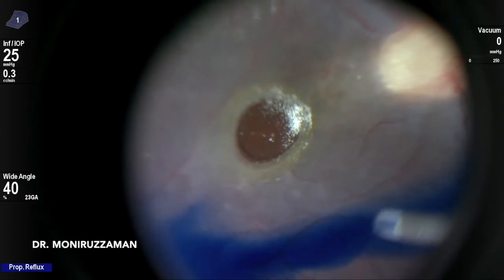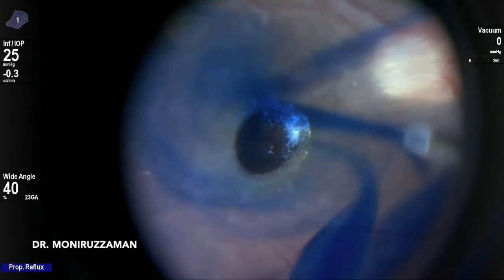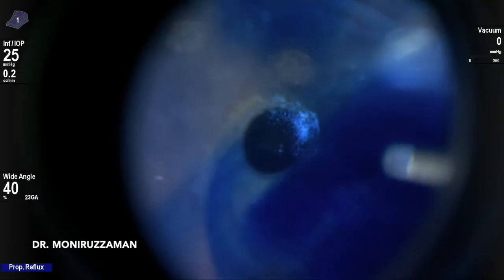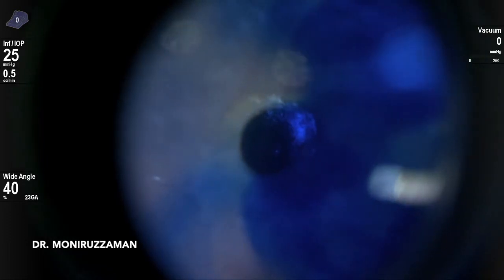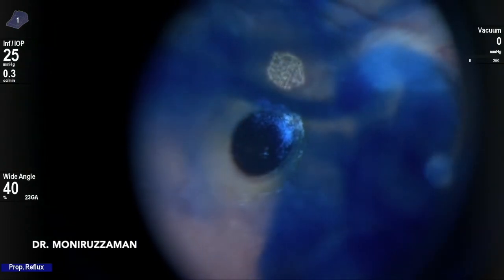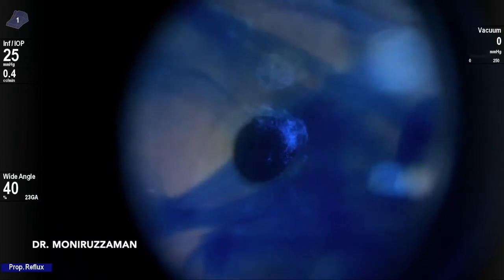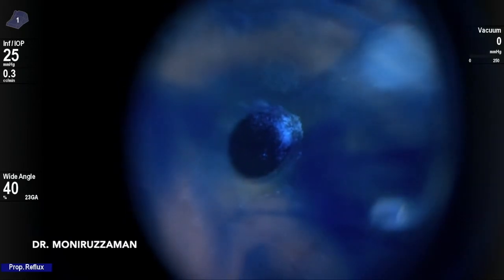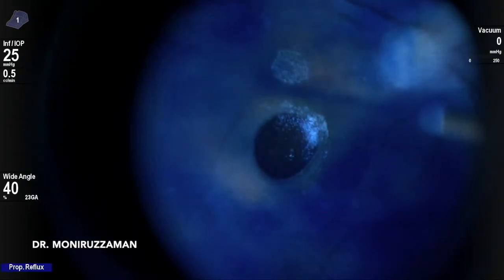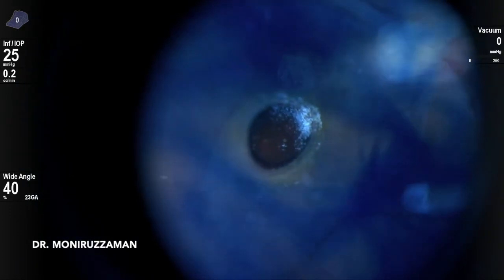For staining, I use a soft tip. I take in the dye within the soft tip by suction and inject it slowly by proportional reflux mode. It gives me the opportunity to go much closer to the retina and stain it in a very controlled way. Complications related to jet flow can be avoided by this method.